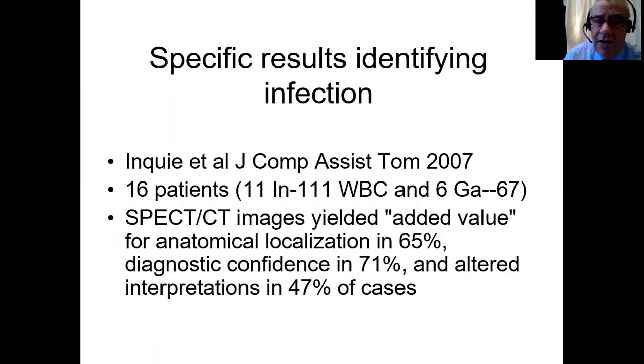So looking at this idea of specificity, a further study was done in 2007, a small number of patients, but they noticed that SPECT-CT yielded what's called added value because of the anatomical localization. And I think the next thing is very important. It improved diagnostic confidence, and the reporters said that they were much happier with their report. And in about half the cases, it did alter the interpretation.